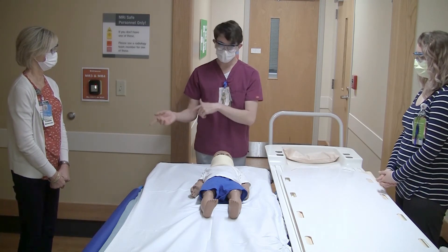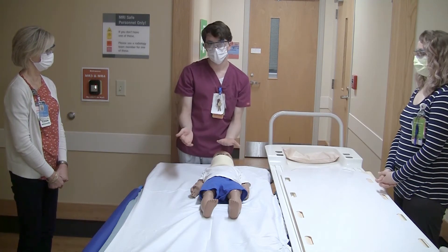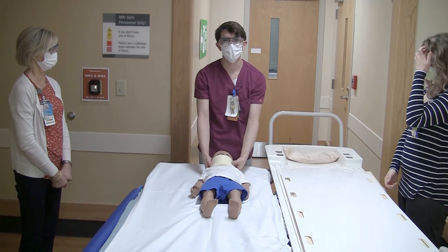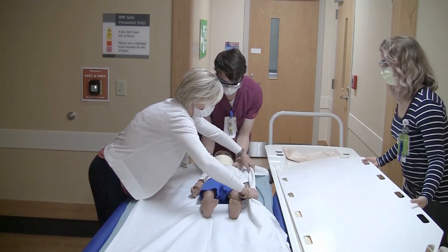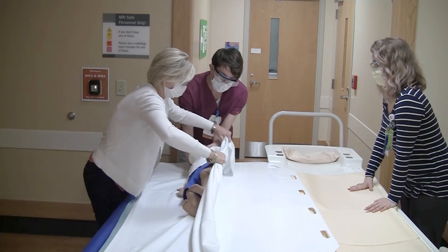The first thing we're going to do is have Diane grab this side of the sheet and lift it so that Jordan can gently put the board underneath the patient. This will all happen on the count of three, and since I'm at the head I will be the one to count. One, two, three. Gently lifting up the patient, sliding the board to about mid-back, and then gently rolling them back.